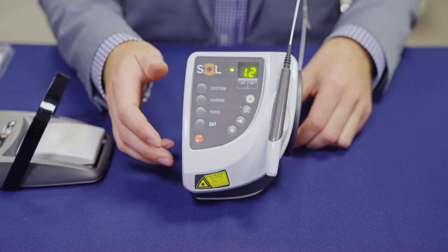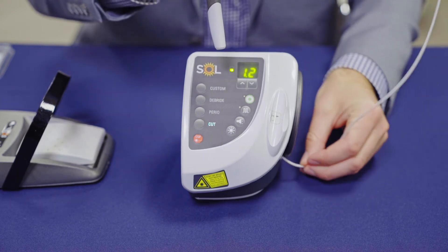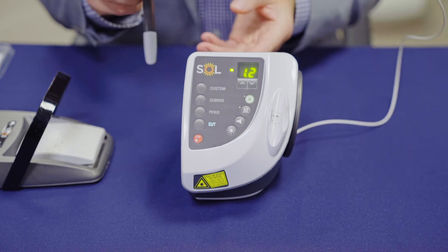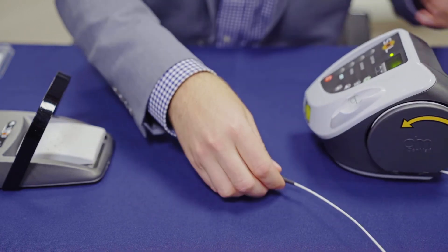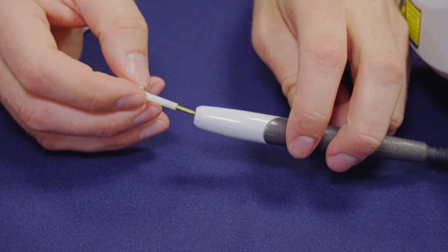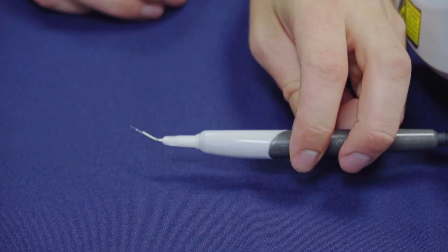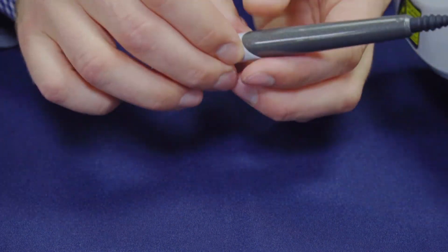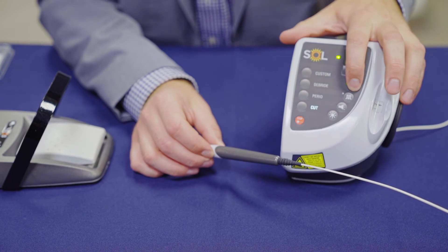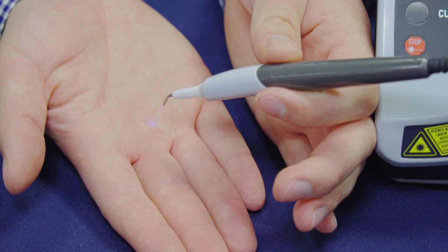Now we're ready to use the laser. Take the handpiece out of the holder and unwind it very gently. Keep in mind that this is a glass fiber, so you're going to want to be gentle with it. Then take one of the disposable single-use tips out of your casing. Be careful not to touch the end — you don't want to add any contamination to it. Slide it into the unit. Once you're ready, press the green ready button. You'll now see an aiming beam and your laser is ready to be used.